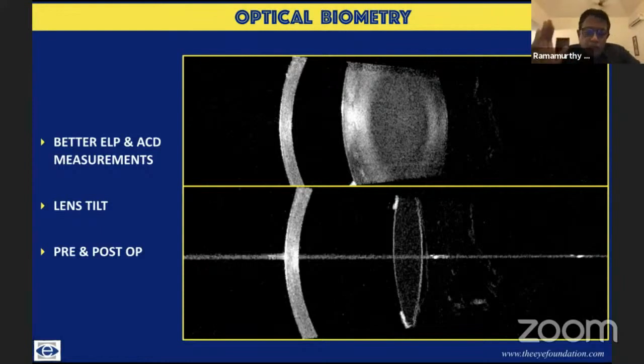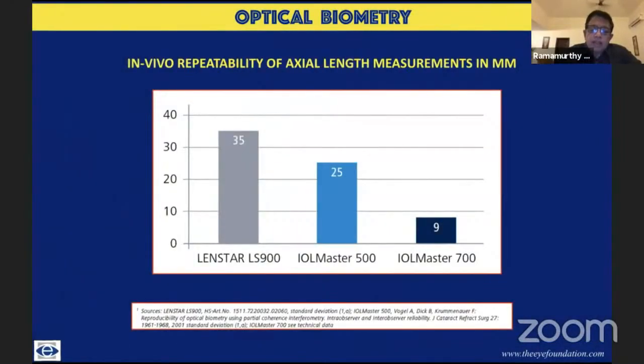Most often, both the natural lens as well as the pseudophakic lens that we place is tilted a little nasally. And this is supposed to have an impact as far as the astigmatic outcome is concerned. And work is on to incorporate this as far as the exact orientation of our intraocular lenses is concerned in the toric intraocular lenses. This is work in progress, but suffice it to say that if a significant tilt is noticed, then these cases may be ruled out for premium intraocular lenses.